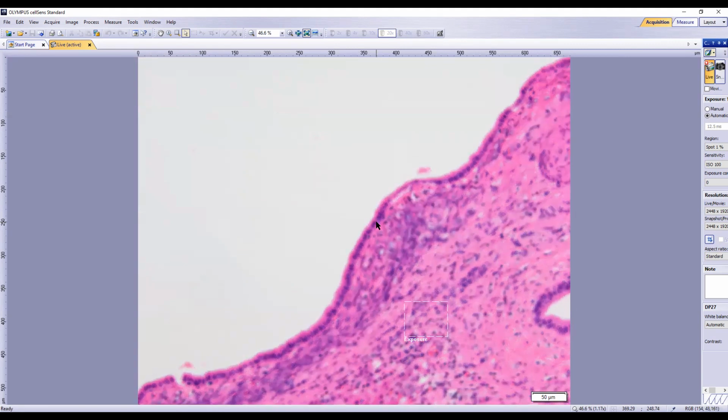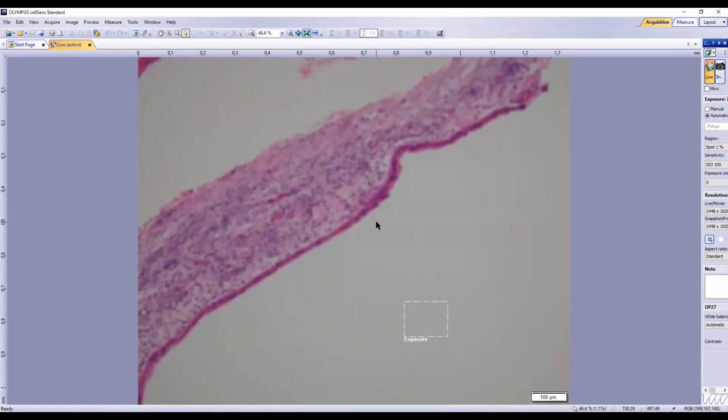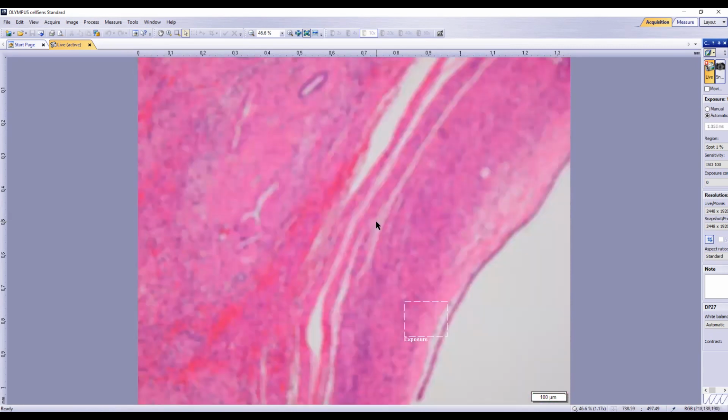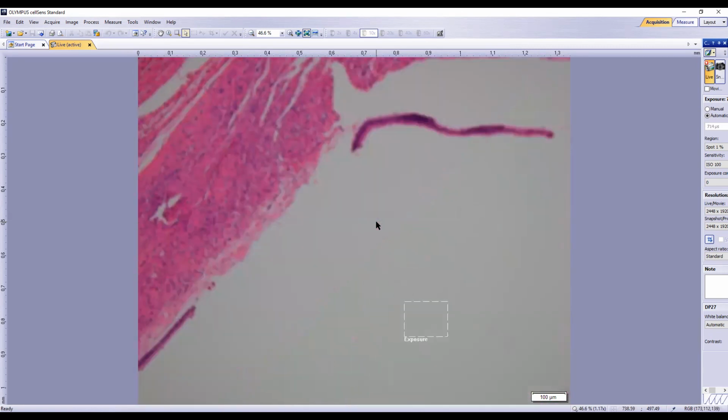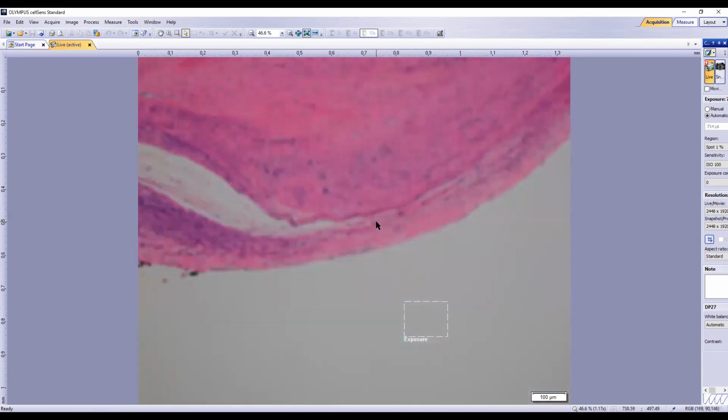One thing though, mucinous cystadenomas should be sampled entirely because there is a chance of focal high-grade dysplasia and carcinoma in these. So the cyst should be sampled completely. And when you completely sample it, there will be one focus where there will be mucin in the epithelium. So I think this one did have very focal mucin. I'm trying to see where that focus is. But like I said, lack of mucin should not dissuade you from making this diagnosis.